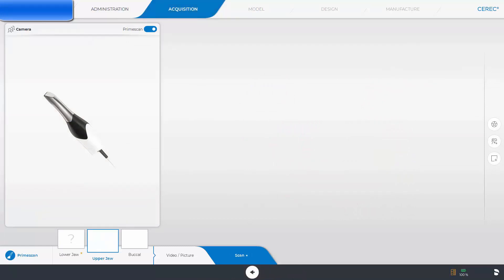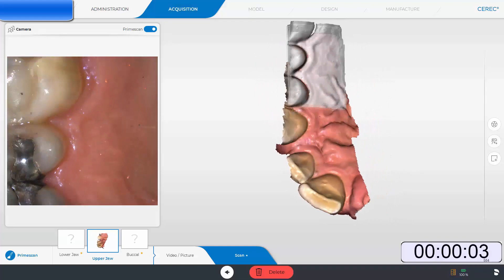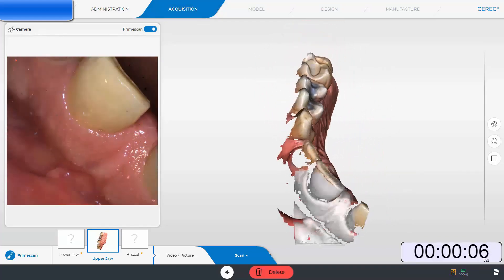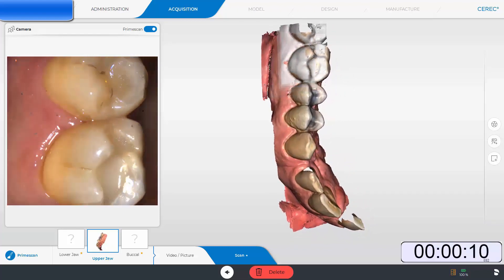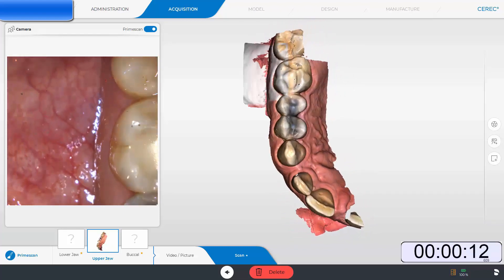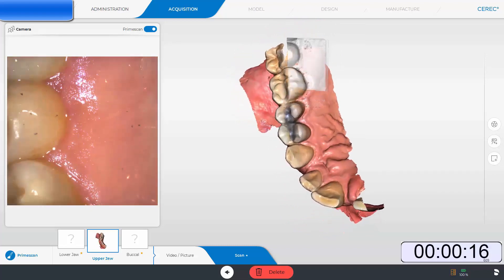Finally, my favorite part of the PrimeScan on the CEREC-5 software: the software integration and automation. In this case, I am showing a biogeneric zirconia crown on tooth number 18 where from the second I start imaging to the second the restoration is sent to the mill is 1 minute and 40 seconds.